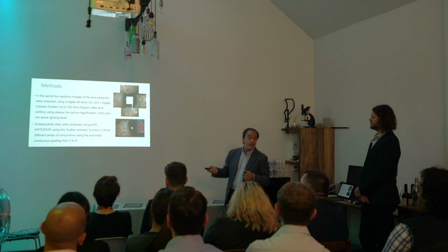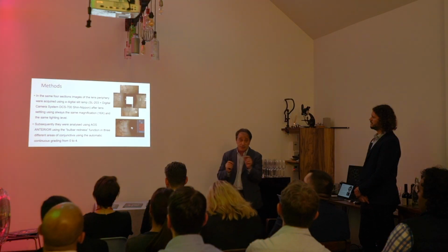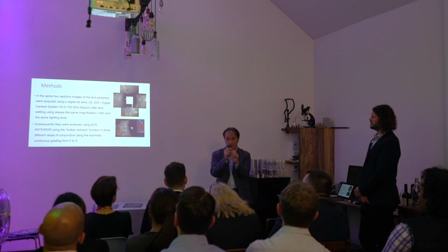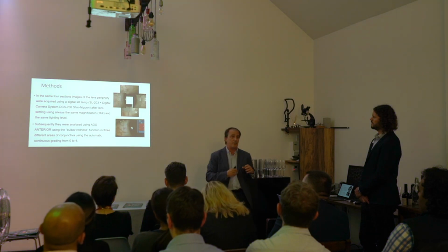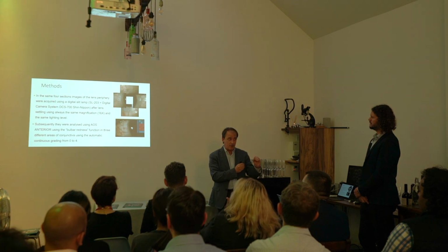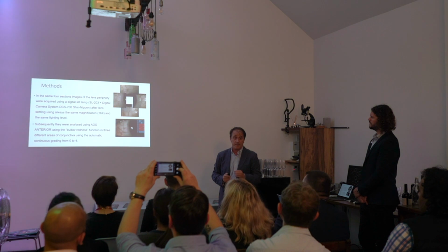And we did the same thing with the AOS. In this case, we use the comparative function, and we introduce another small area to evaluate the redness, and so the results obtained in these spatial areas.